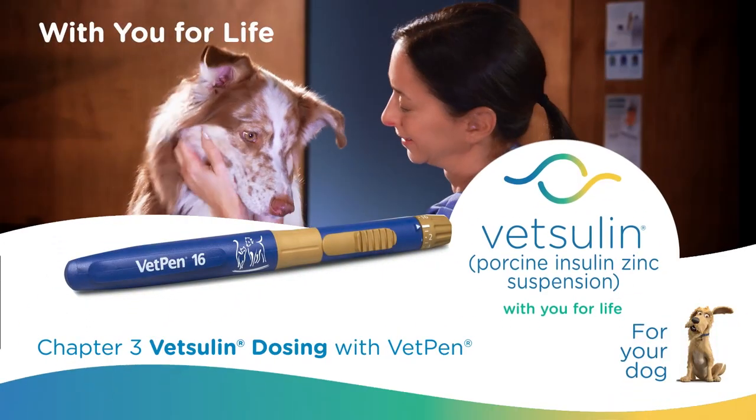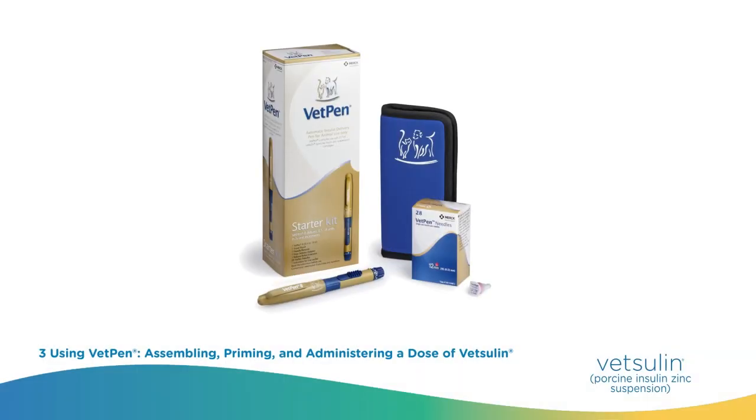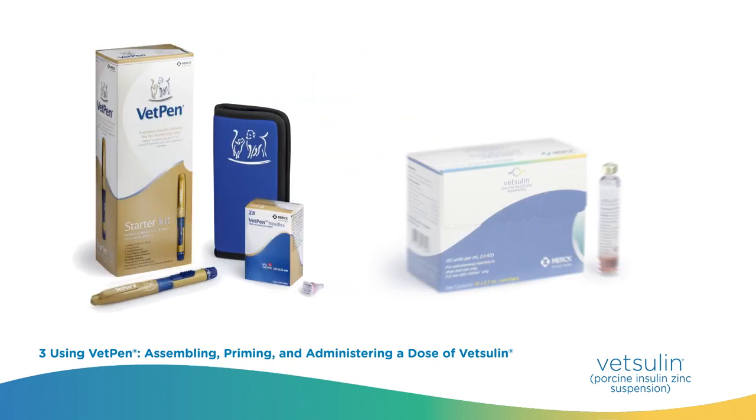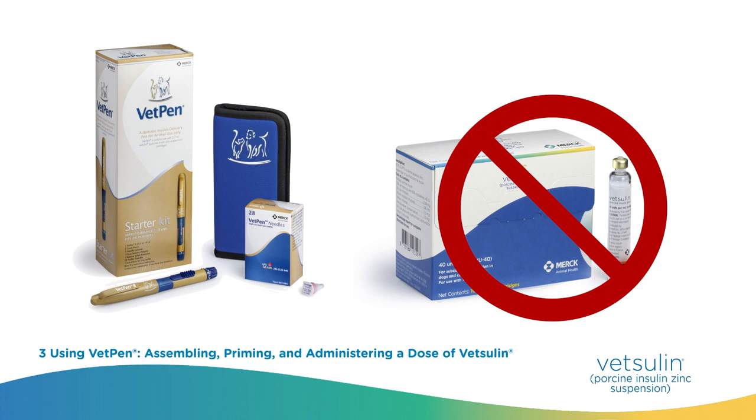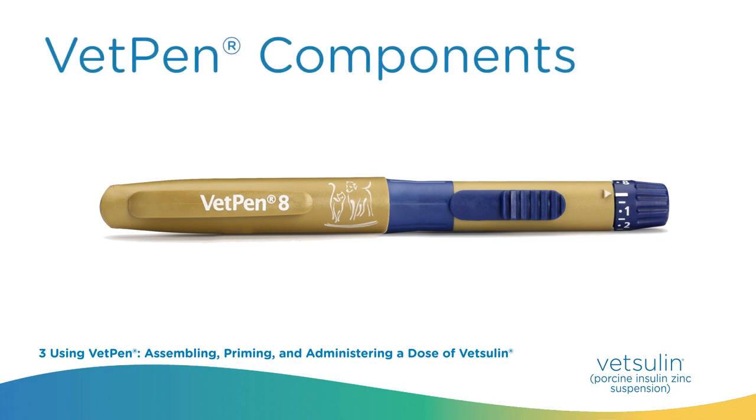VetSulin dosing with VetPen. It's easy to get started with VetPen. The starter kit for pet parents has everything needed and each component will be identified here. Please note that the VetPen starter kit does not come with a Vetsulin cartridge. Prior to using the VetPen, it is important to know the parts listed in the instructions.